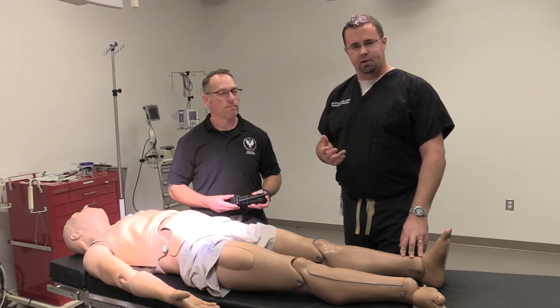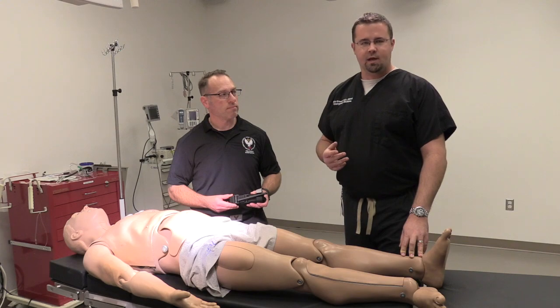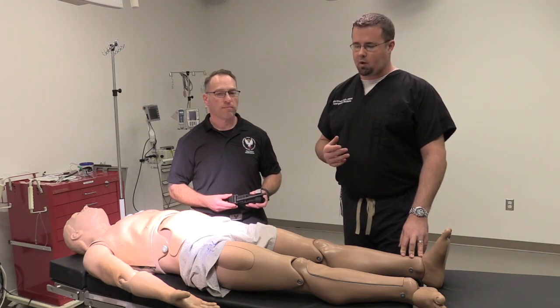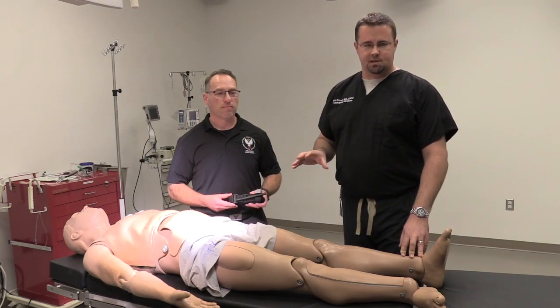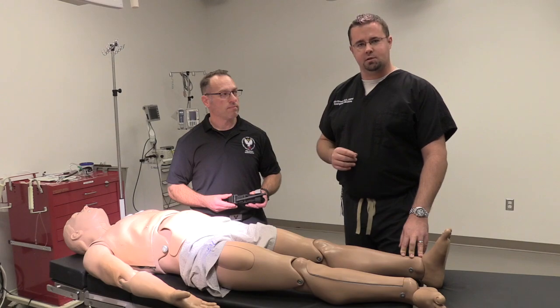And you look at some of the literature, these are safe for multiple hours of use. And so really within an urban system where we're going to get them to the hospital within a relatively short amount of time, this is safe for application, and we're not going to be losing limbs unnecessarily just because of the tourniquet application. So very safe thing to use and great to control that life-threatening hemorrhage.